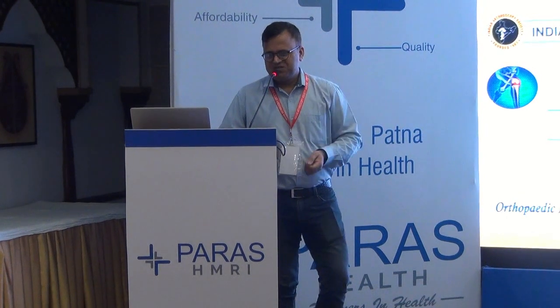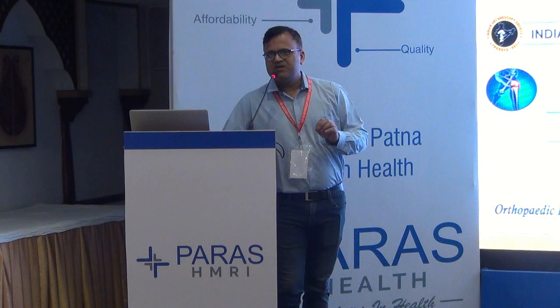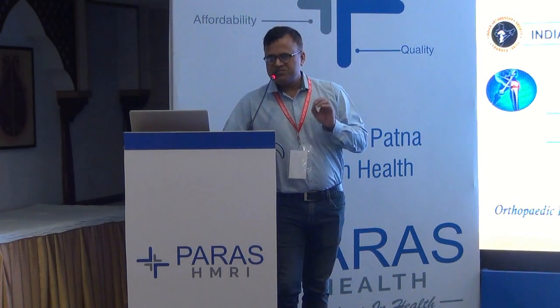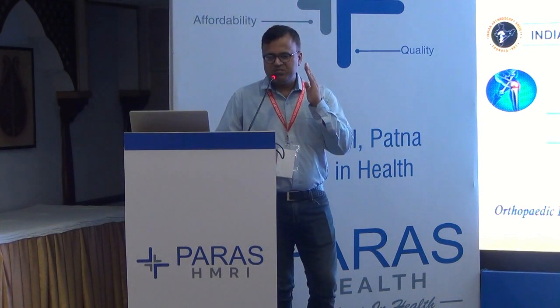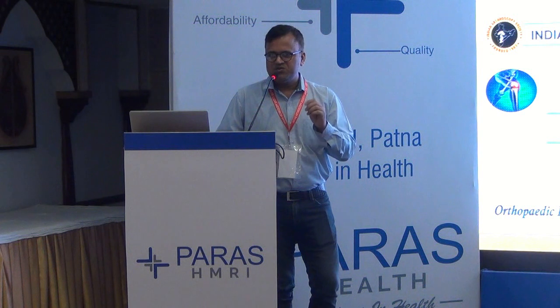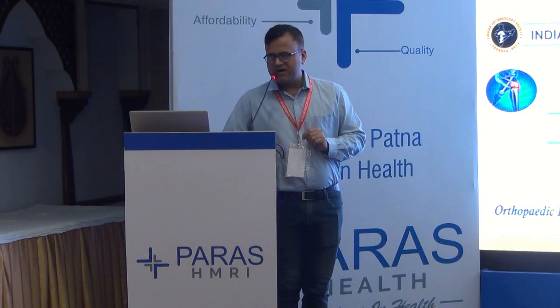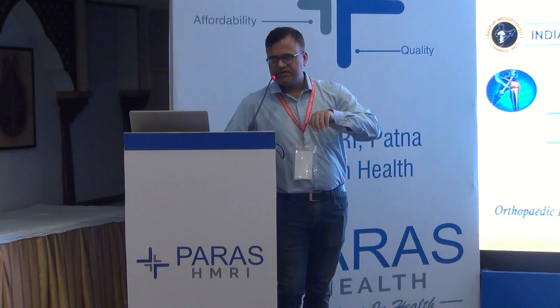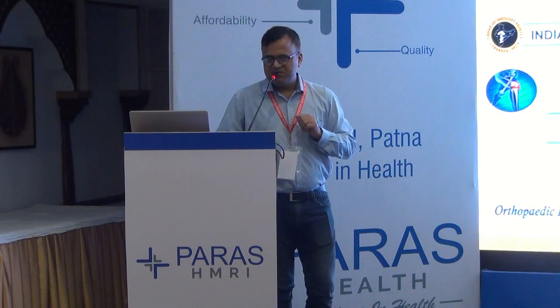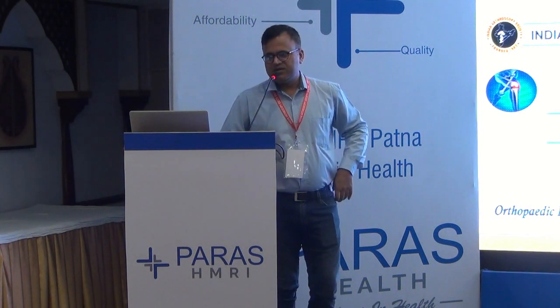So I just leave it at that. These cases I just leave as such. But in the discoid meniscus, many times there is hypermobility and there is peripheral tear. So in the most posterior part, I use the all-inside device to repair that part. But coming to the body and towards the anterior, I believe in the inside-out technique for repair of that kind of meniscus.